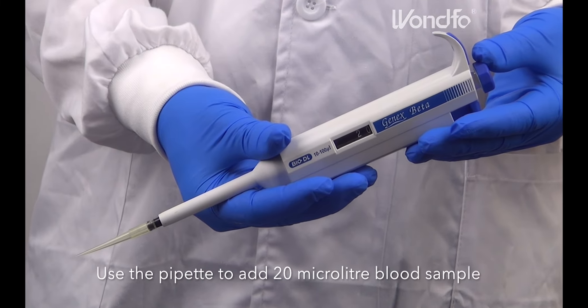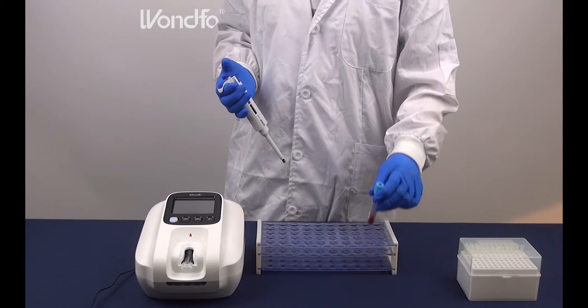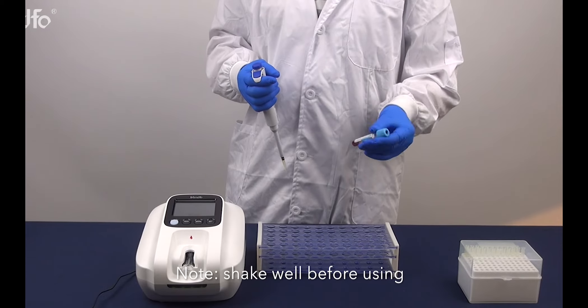Use the pipette to add 20 microliter blood sample. Note: shake well before using.